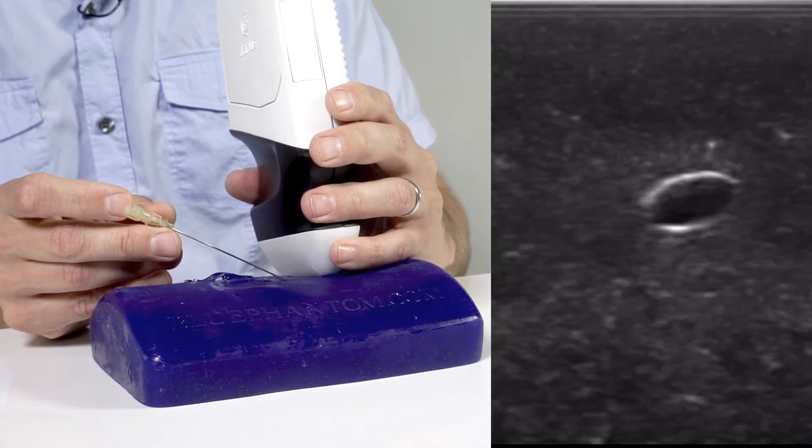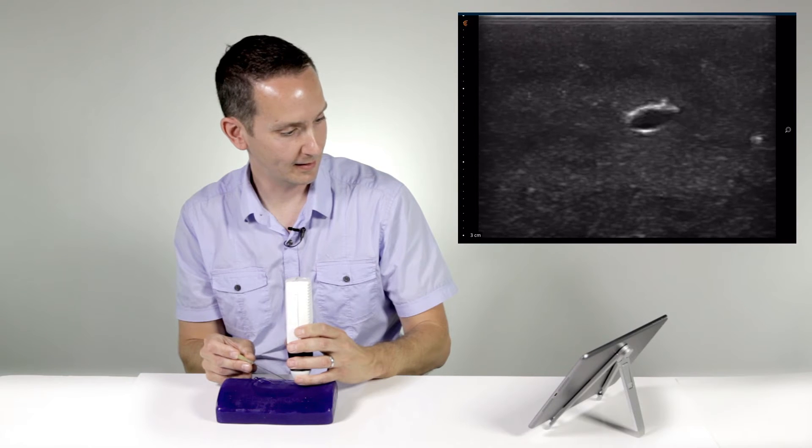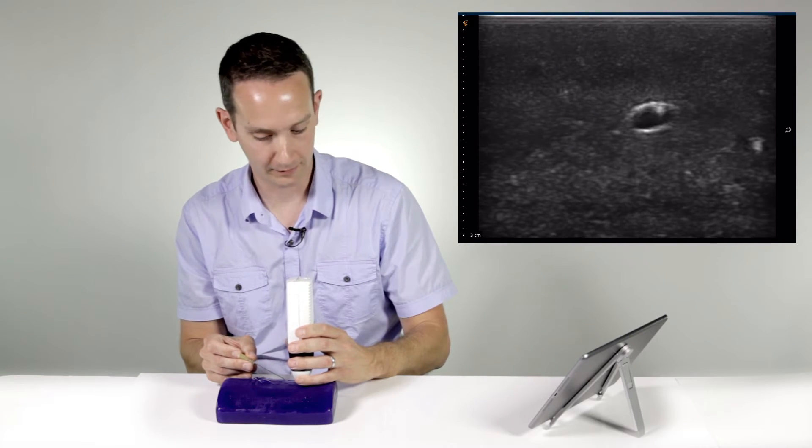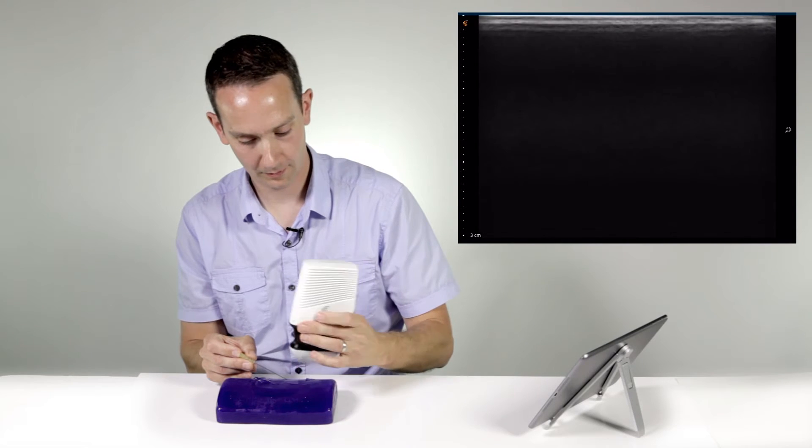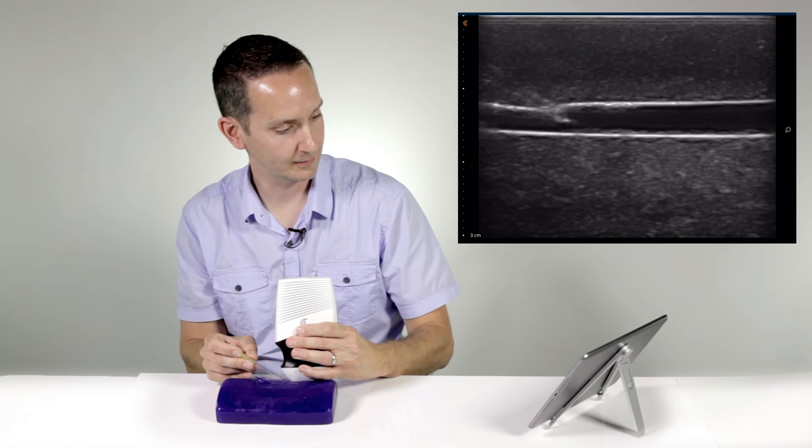Advance the needle a little bit more. Stop, slide, stop, slide away, and at this point you can ensure that the needle tip is entering the vessel by turning it into a longitudinal axis and there's the needle tip in the vessel.